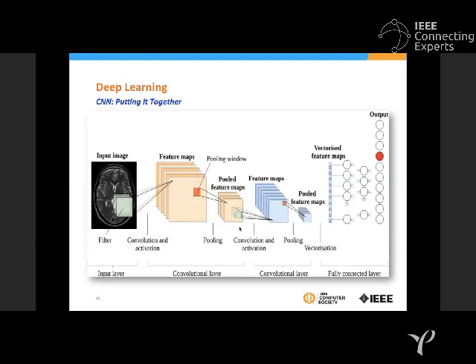And this vectorized feature map is very good to run through your fully connected network and can give you a good score in terms of your outcome.